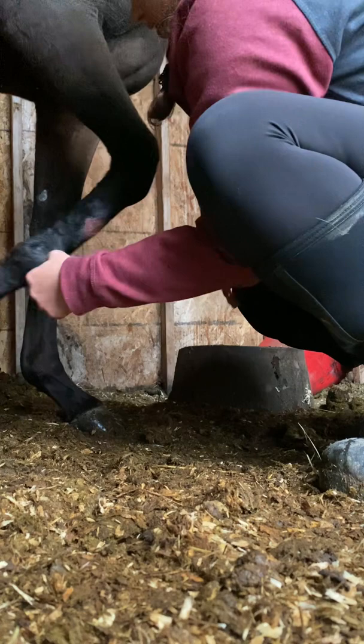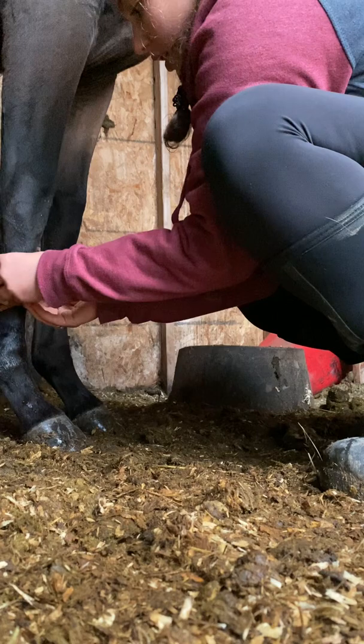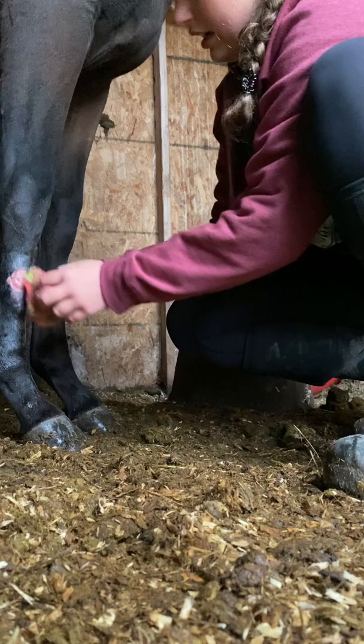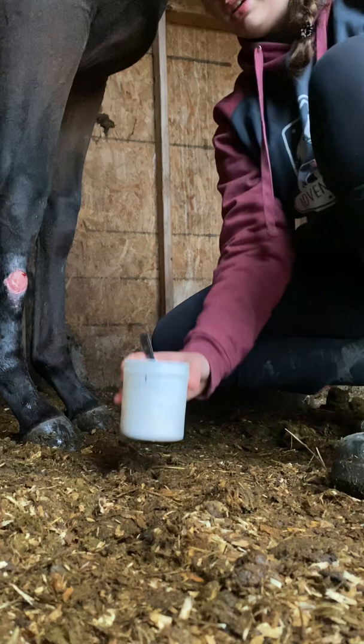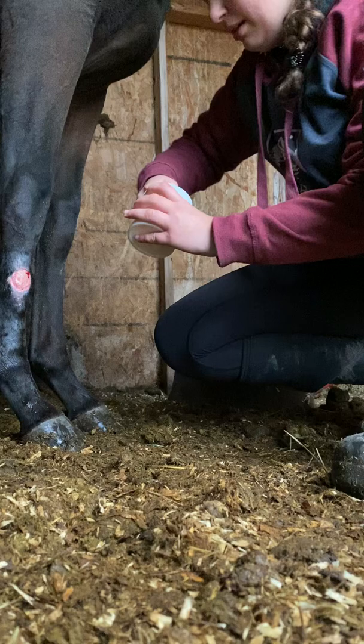Because I really don't want to hurt him too much. And then you've got to make sure that all debris are clear of the wound, because you really don't want anything in there — so all hair, any hay, anything whatsoever. And then you have to take — I have part of a Teflopad here.